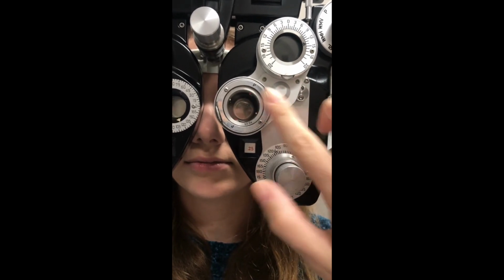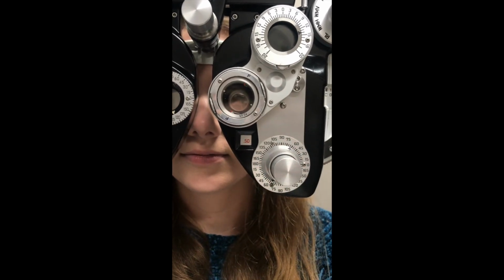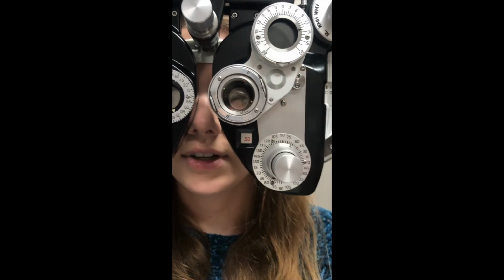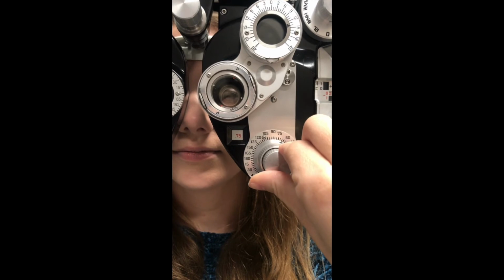Option 2. Option 2, she picked the red dot, so we're going to go ahead and add another 0.25 cylinder. Okay, Abigail, do you like option 1 or option 2? Option 2. Once again, she wants to add another 0.25 diopter.